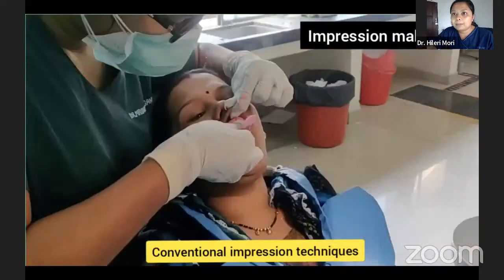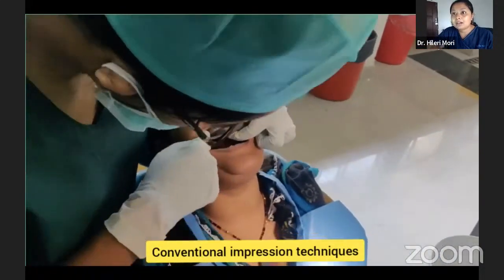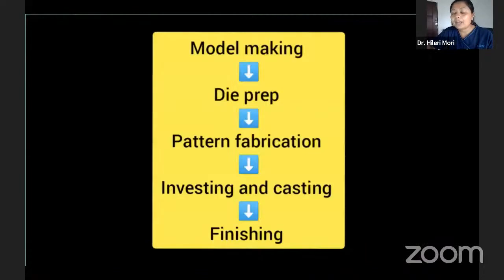Here I have put a small video for you guys. This is how we make an alginate impression, starting with the tray selection and loading the material correctly, and making the impression correctly, followed by disinfection.